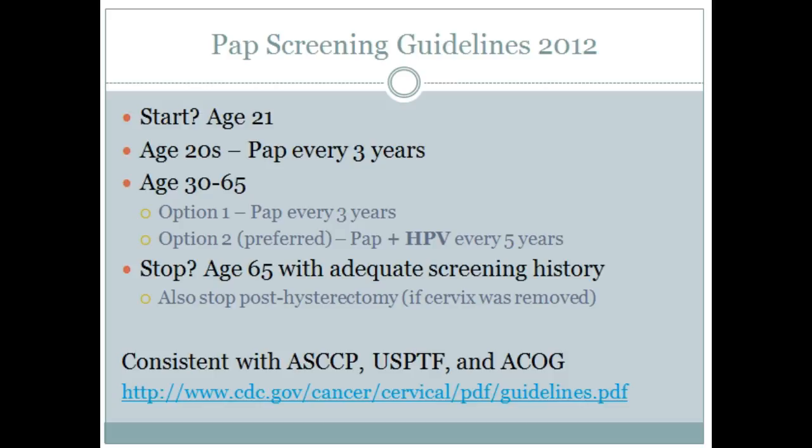If she had endometrial cancer and her uterus was removed and there's no cervix left, some studies are suggesting that we should continue to pap. You wouldn't really have a cervix to pap, but you can see a line of staples at the end of her vagina where it's been essentially pouched off, and that's what you're going to pap.